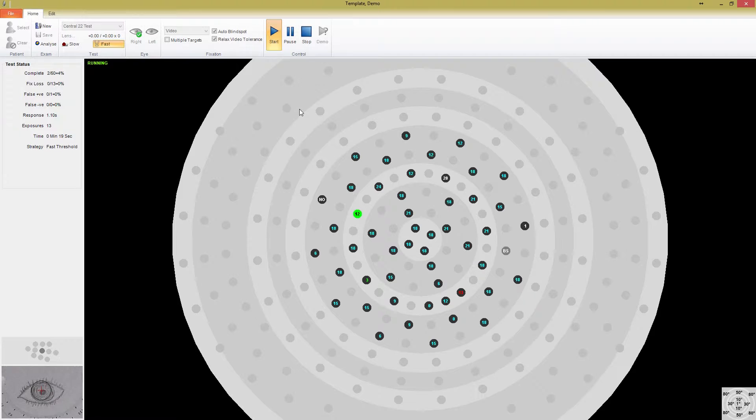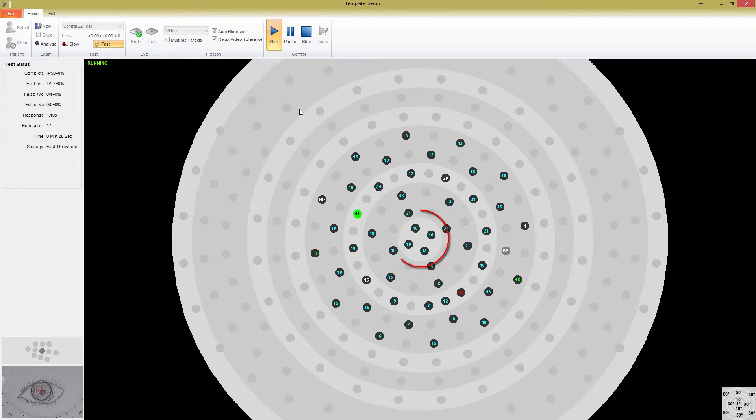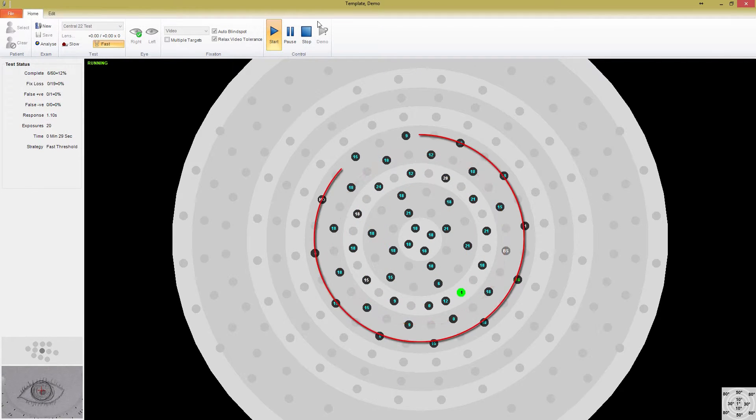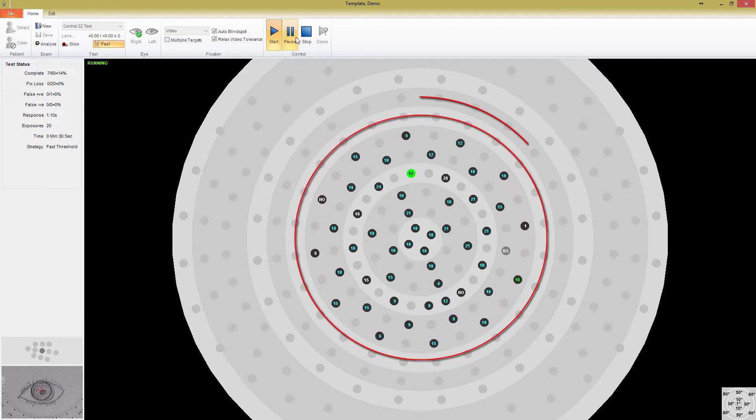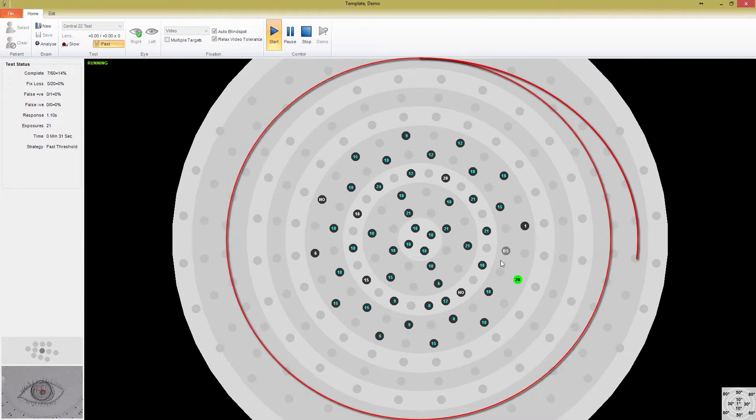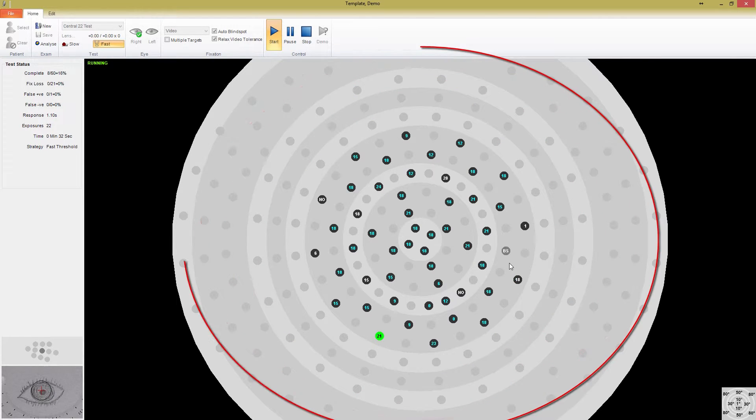The stimulus points are arranged in concentric circles, with radii starting at 1 degree and extending out through 3, 6, 10, 15, 22, 30, 40, 50, 60, 70, and 80 degrees.